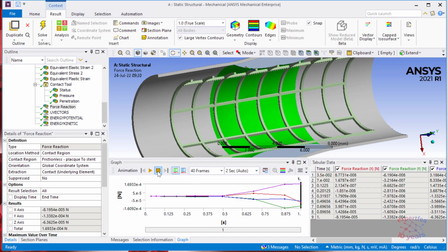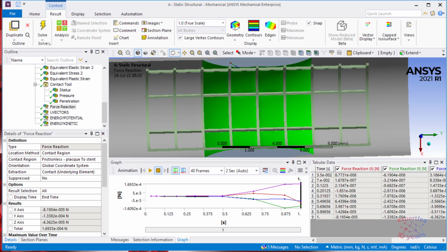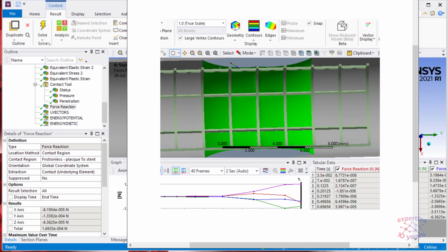Why is this useful? We can find out exactly the surface that gets into contact. Let's draw a little. What gets into contact exactly is only such faces, continued on the entire circle. Here, and maybe here, and continued on, also here, also here, also here, all these small windows.